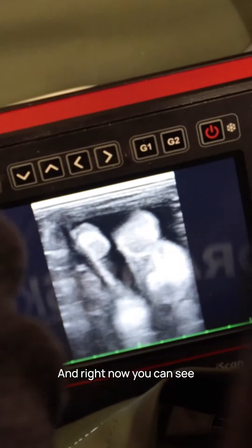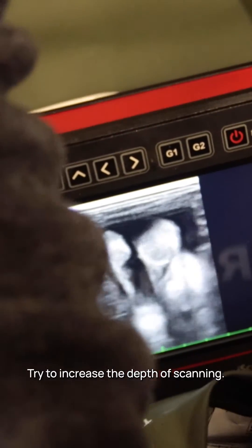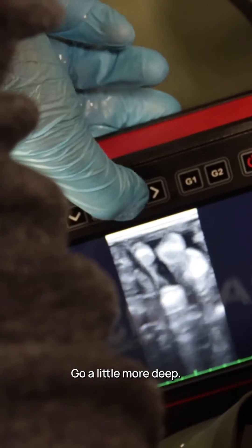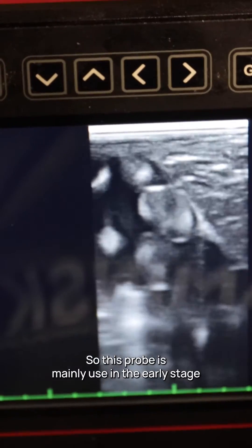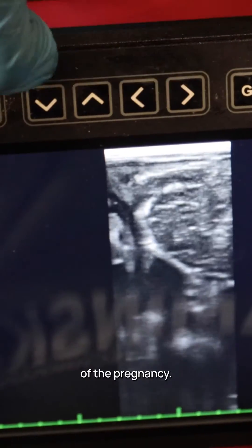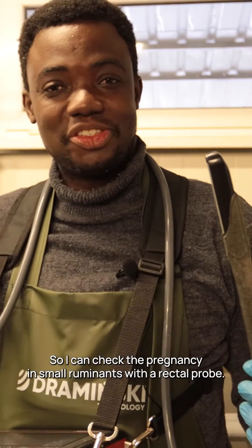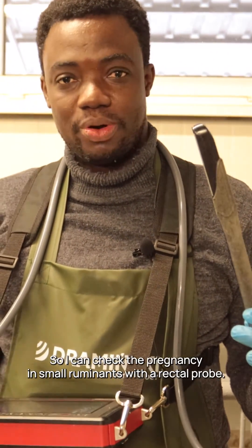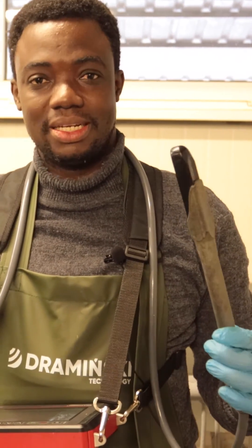Right now here you can see cotyledons. Try to increase the depth of scanning to go a little bit more deep. This probe is mainly used in the early stage of pregnancy, so I can check pregnancy in small ruminants with the rectal probe, which we just demonstrated.